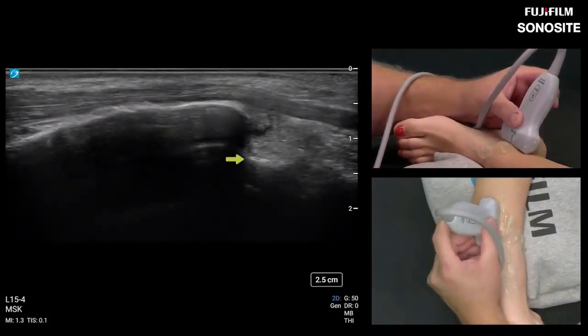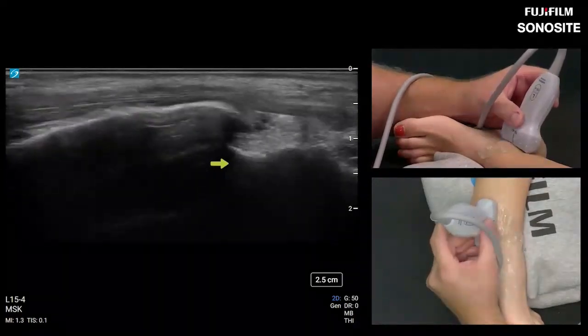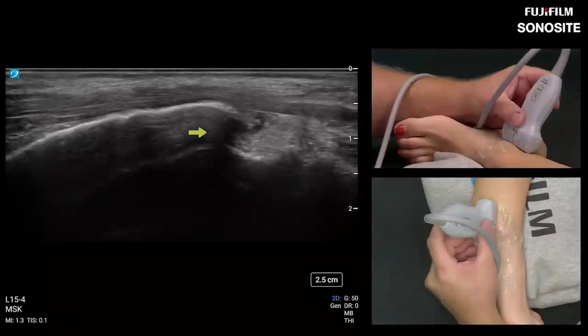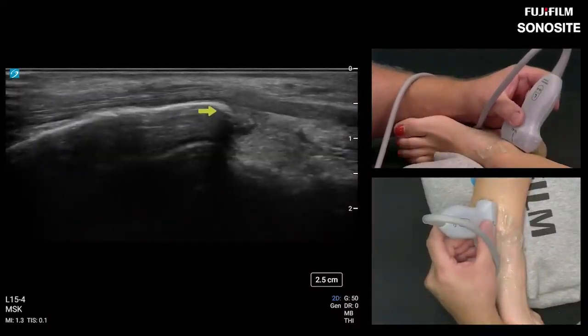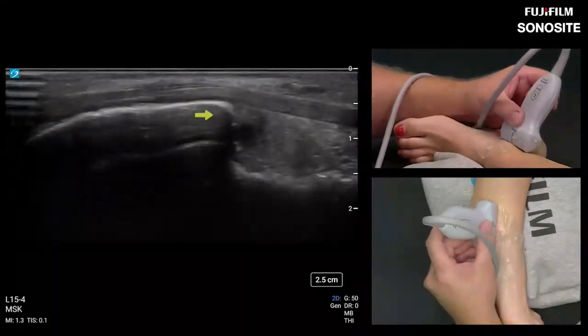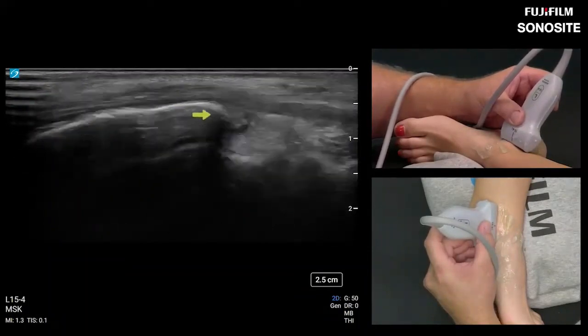And distal to the malleolus is when the tendons start going their different directions. We talked a little bit about that in the anterior ankle exam, but the same thing applies for the medial and the lateral exam: once we are proximal to the medial malleolus, we really don't have to move our transducer that much. But once we go distal to the medial malleolus, that's when they all start heading their different directions to their insertions.